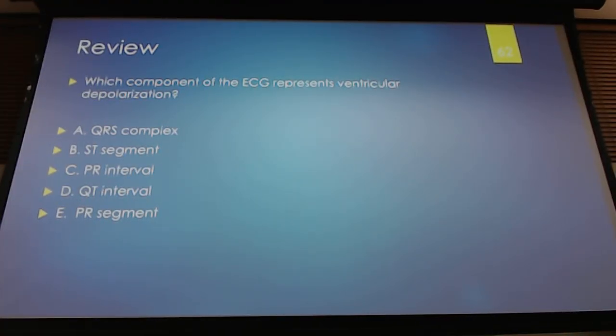Okay, which component of the ECG represents ventricular depolarization? QRS, right? We didn't say only depolarization of the atria. We had ventricular depolarization, that's the QRS complex.